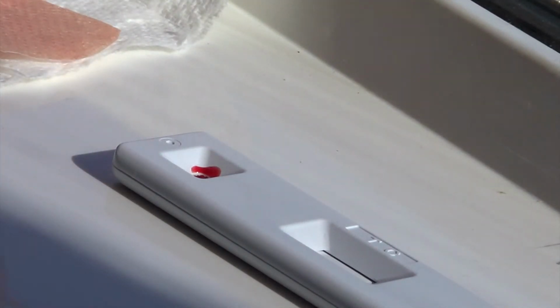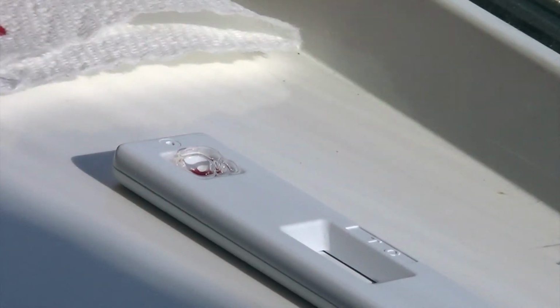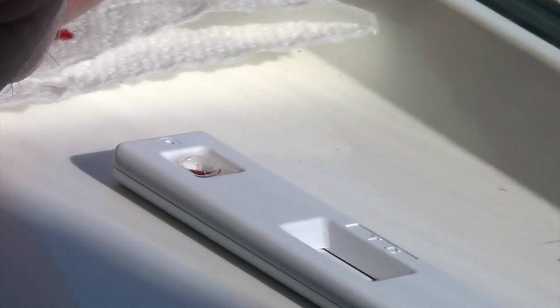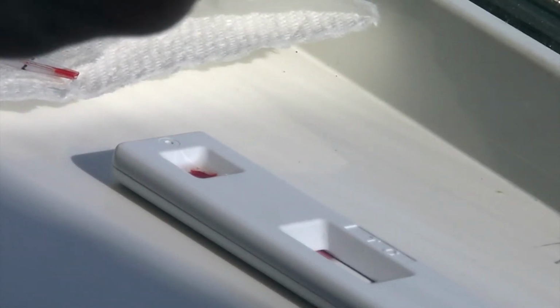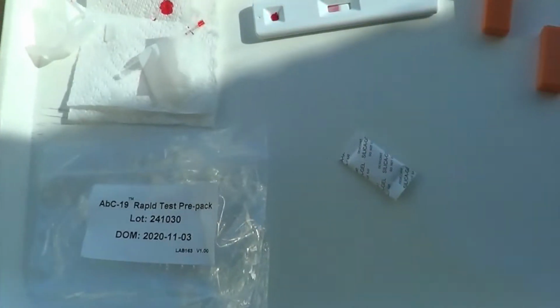And then again quickly take the top off the little bottle, break it off, and then add all the liquid that's in here into it. Now I can see why this tissue is useful, because you have a little bit of blood excess there. So I just dab that on the tissue, take my sticking plaster, get it on to avoid making a mess with blood, because it will keep running. I think the little lancet has probably got a bit of anticoagulant in it to help the blood flow when you jab yourself. So that will probably keep the drop running for a bit unless I put a plaster on. And that's it. And now all I have to do is wait. Voila. All I have to do is wait 20 minutes for the final result.